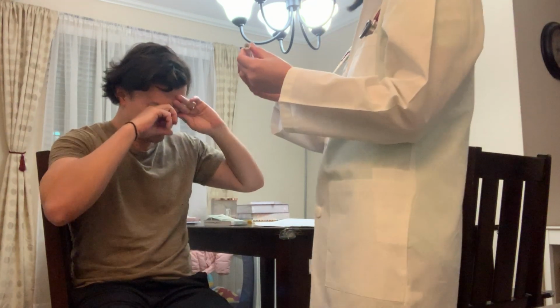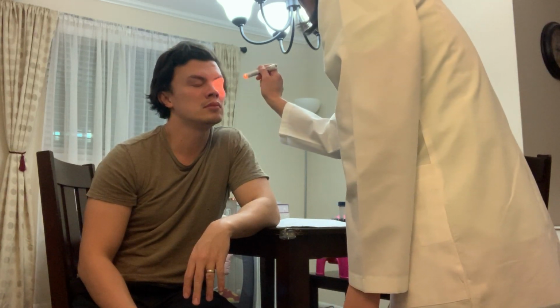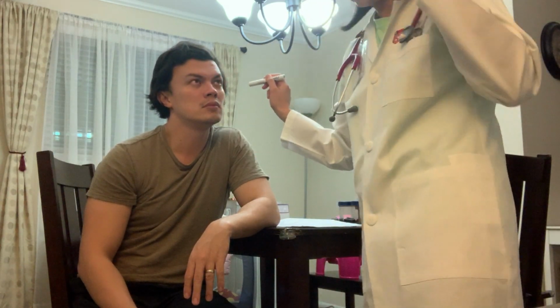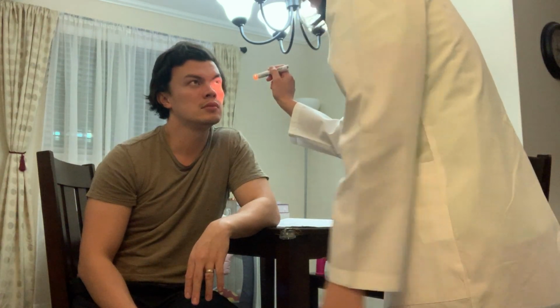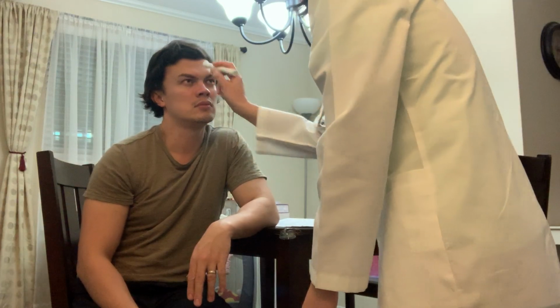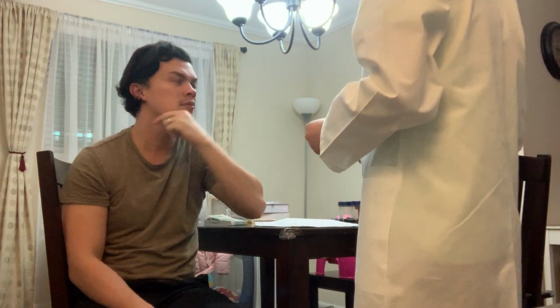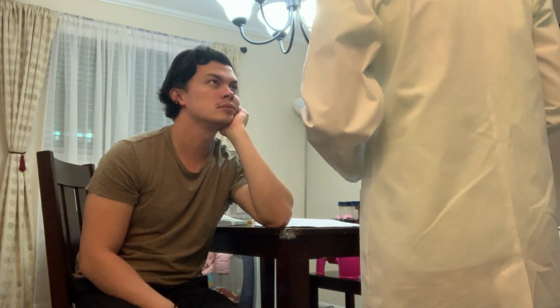And then after that, we're also going to check for pupil reaction to light. So using my pen light, checking for pupillary reaction to light directly and consensually. Usually what we would do to test this is I would flash the light to my patient's left eye, and it should constrict, and then the right eye should also constrict, and the same way for the other pupil.